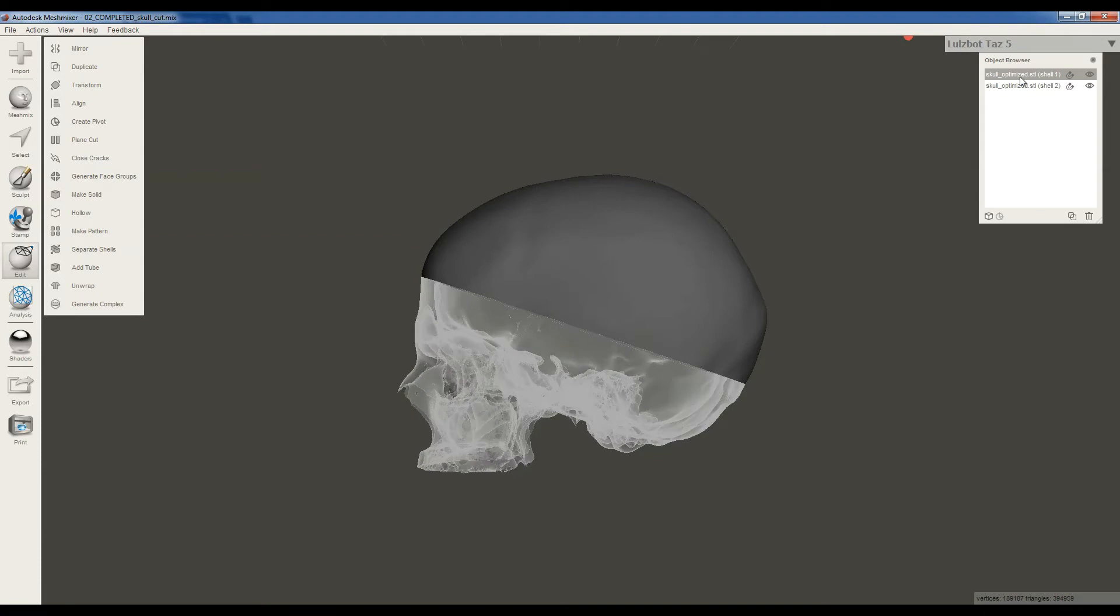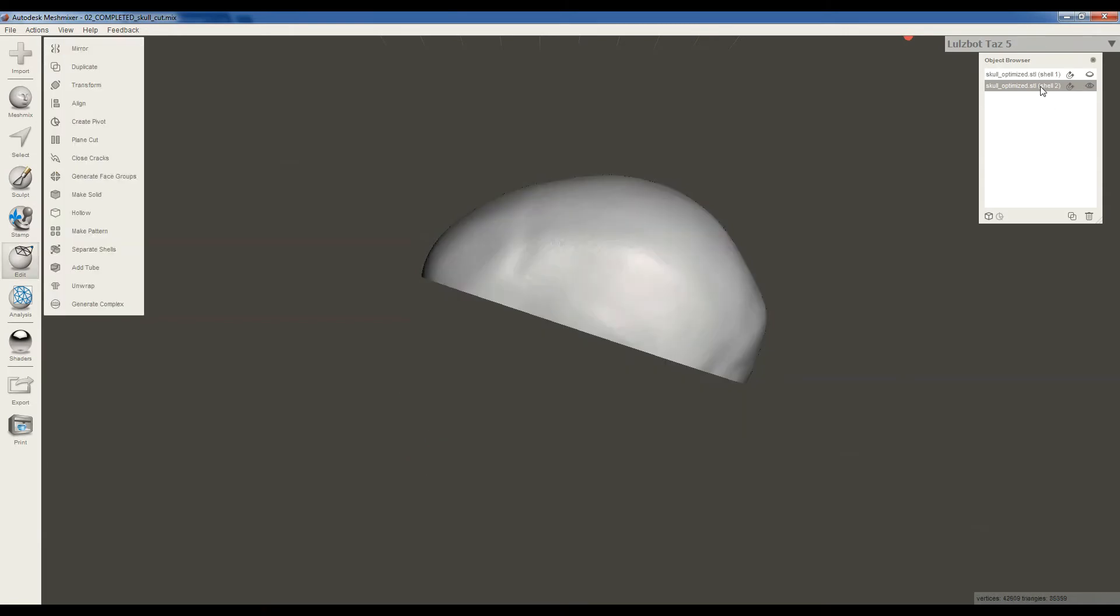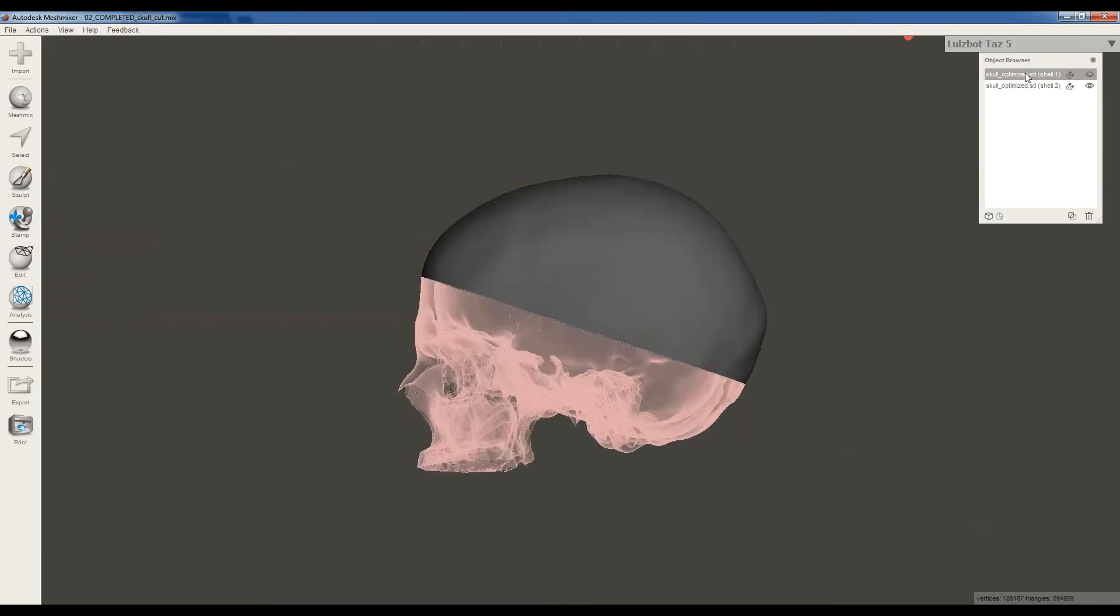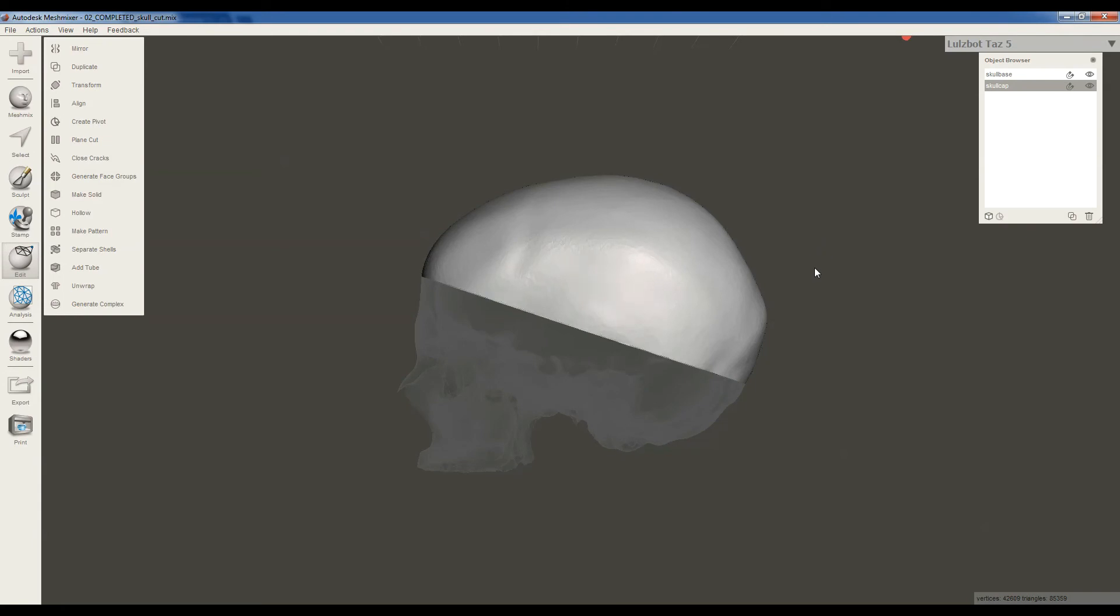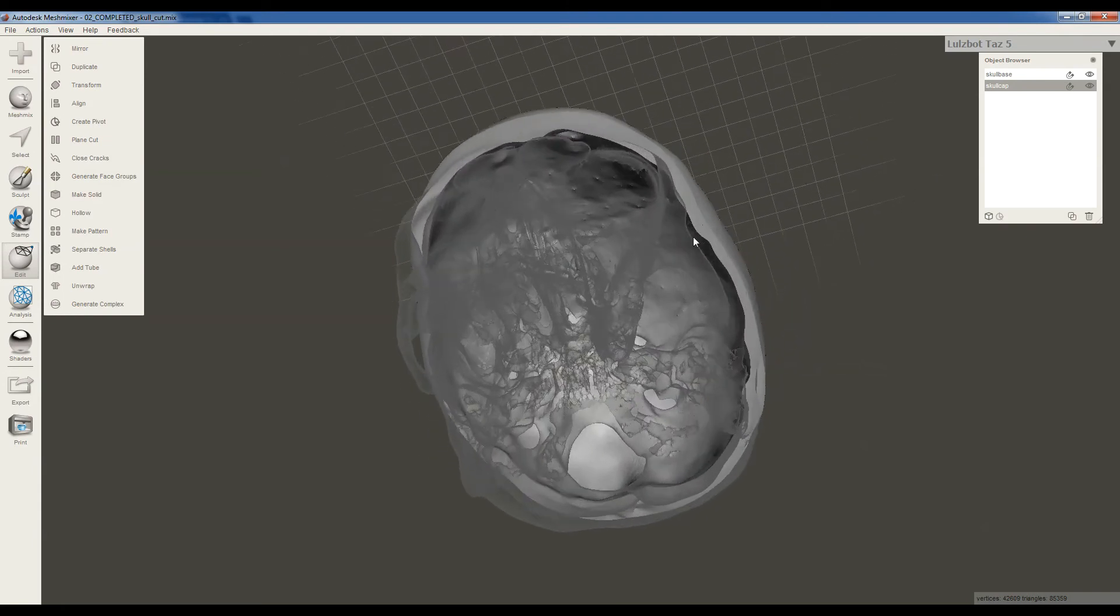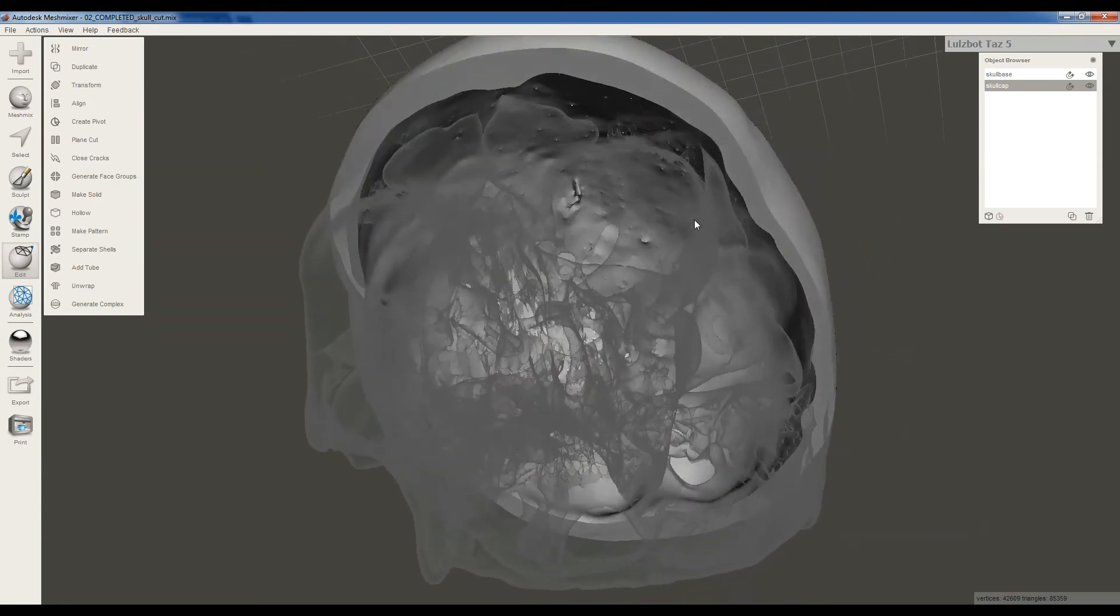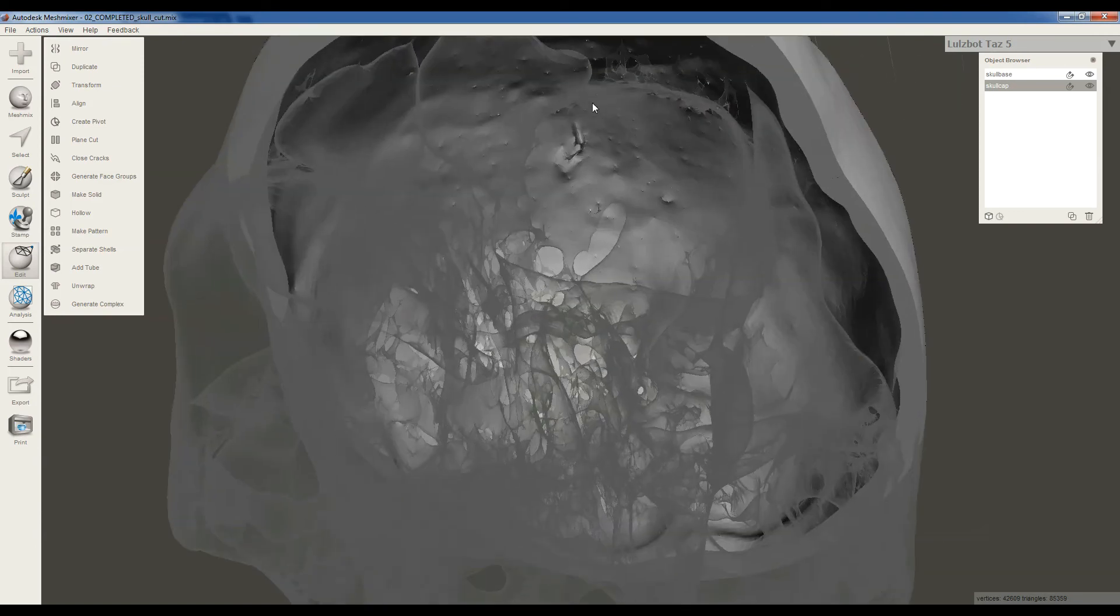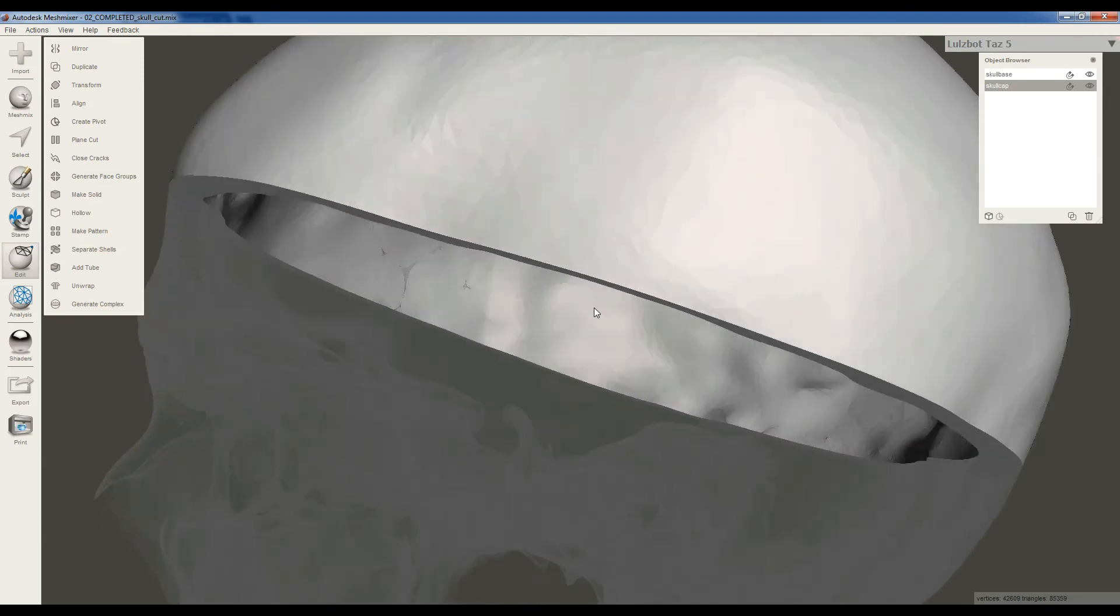Now you might kind of wonder, well, which model's which? So you can hide one, and that'll kind of make it clear. So the one we hid is the Skull Base, so I'm going to double-click on that and rename that to Skull Base, and the one we're seeing is the Skull Cap. And I'm going to bring both of them up again, and there we go. There's our cut skull. Cool. And you can see that the cut surface now has been filled in, so you don't have a hole along the plane where you cut it.